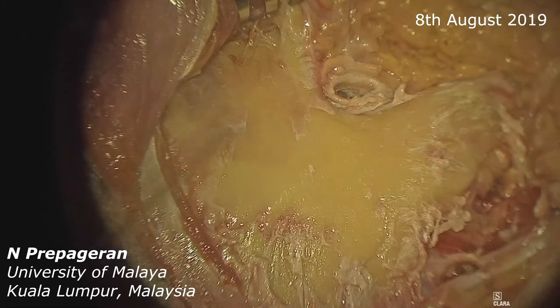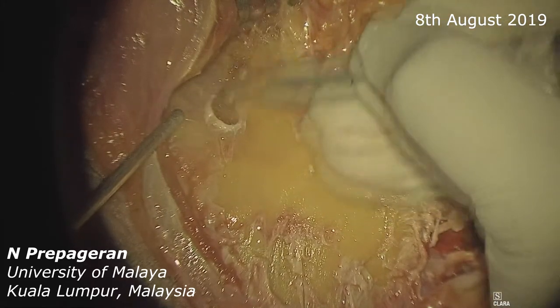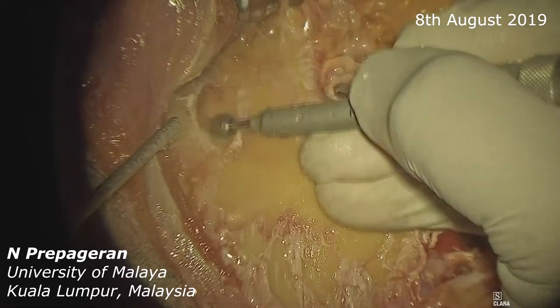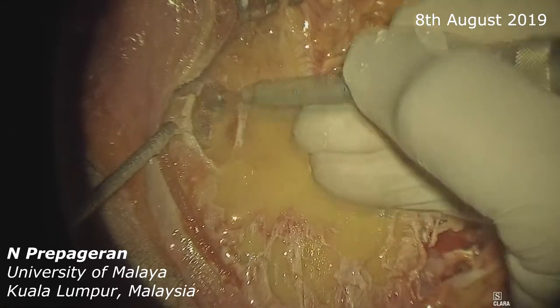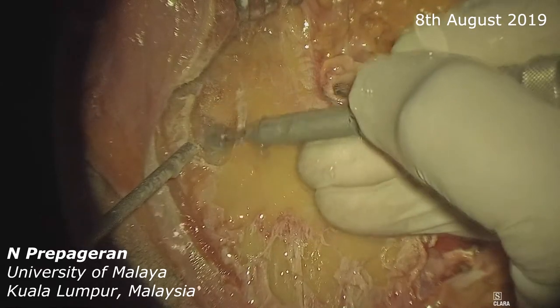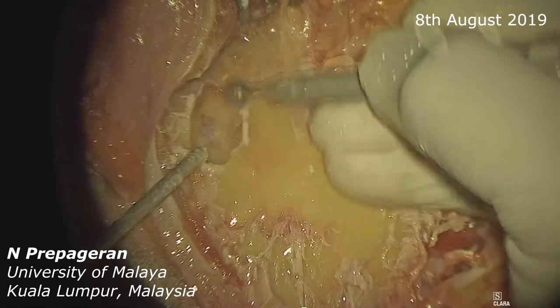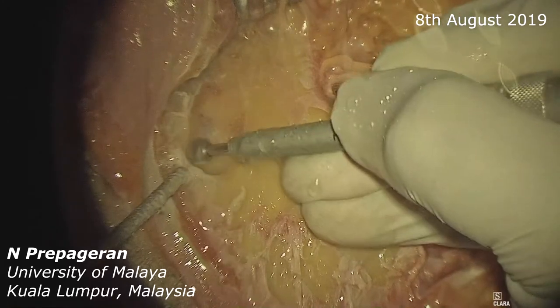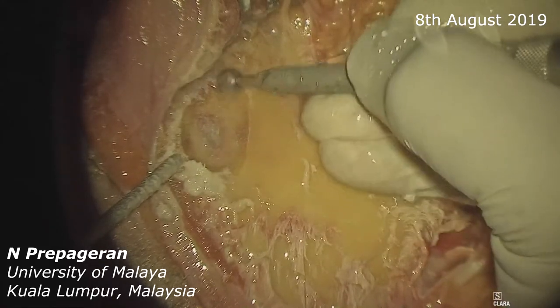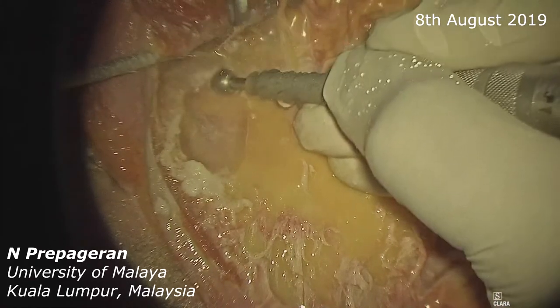Once we have done that, let's identify first of all the dura in the middle cranial fossa. You can easily and very quickly identify the dura of the middle cranial fossa. You can see the sound is changing — when you hear the sound changing, you know that we are very close to the middle cranial fossa.